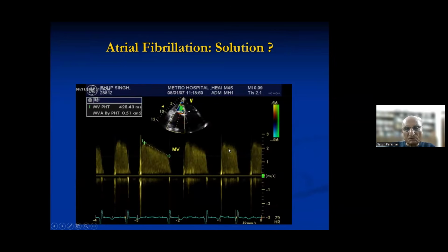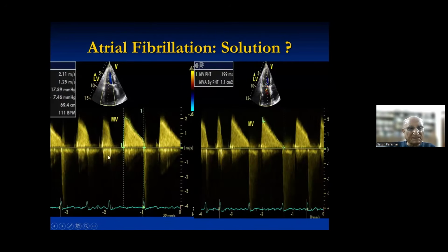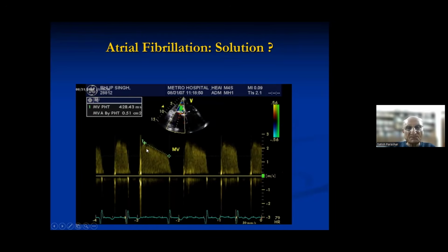You see we could not do anything, but here you see that one slope is always wide, and then you press, you take it, and you get an area of about 0.5 centimeters square. Here you see again multiple, nothing can be done there, but there is bound to be one wide diastolic slope, and out of these three we have taken the widest, and here too we have taken the widest, and this is the mitral valve envelope in that also. So this is how we do it in atrial fibrillation.